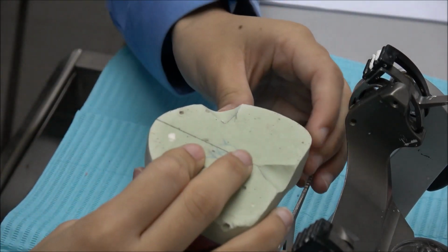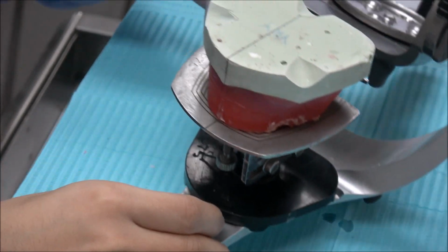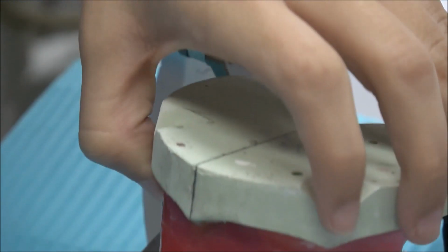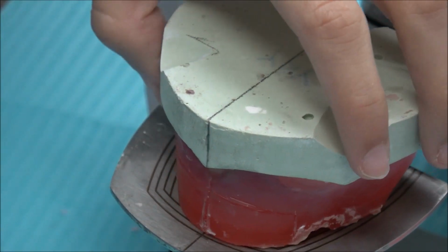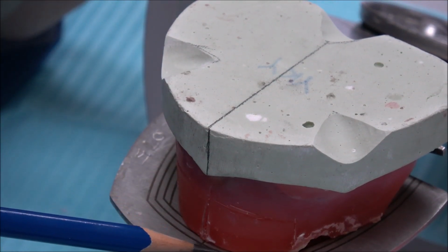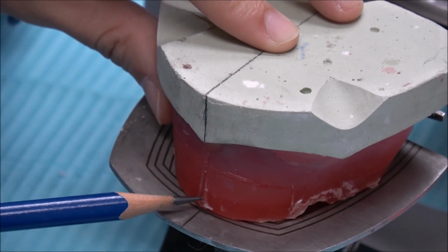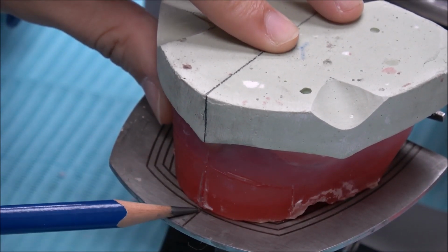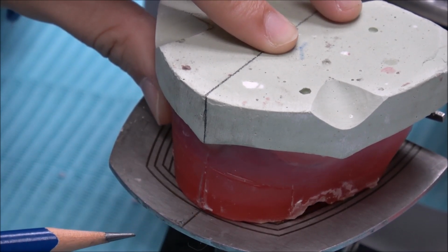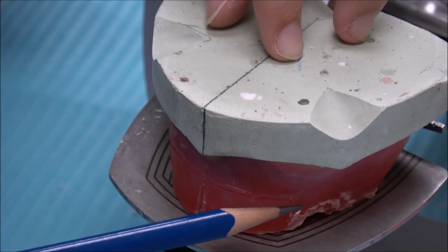So I show you how to place it. First, we place it on our occlusal table. We follow the first line here, the outline, the first outline. And then our midline will follow the line here, the middle line. Here is the occlusal table midline. We follow it, we place it. Okay. And then we have to balance both sides here.